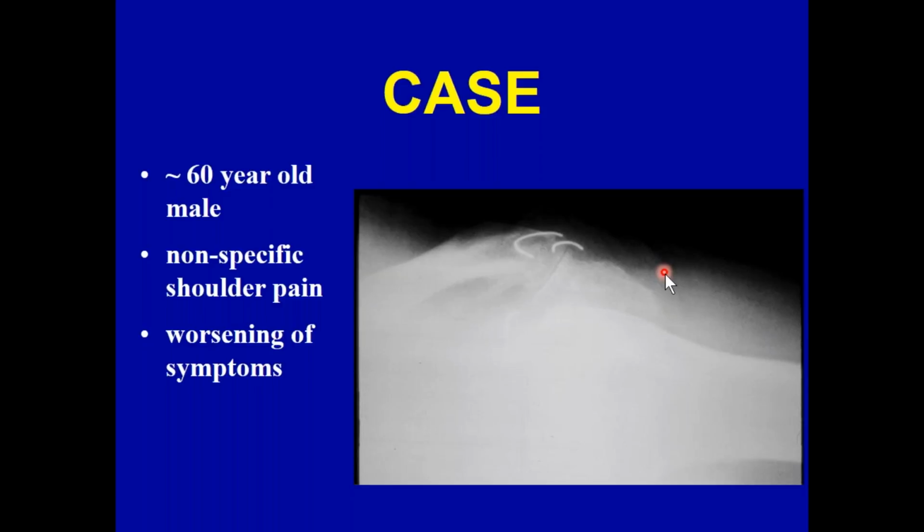unusual to expect for him to have nonspecific shoulder pain, but if we can fix the technical issues with this particular shoulder exam, and if you burn a CD and have the patient take it with them, then whoever he gets sent to can understand why he's not a good candidate for an MRI because of the metal, and they can also see on your good film that you've taken and or fixed that there is this osteophyte that may compromise the rotator cuff apparatus, and that's why he has shoulder pain.